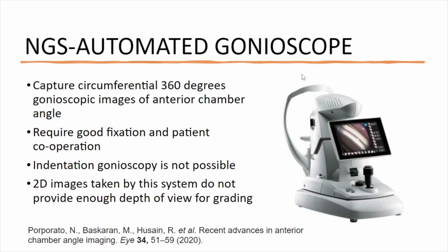But as Bhaskar said, there is no substitute for a good gonioscopy. So it's more important that you spend time learning gonioscopy. You do definitely need to know about this, but gonioscopy is what is going to be your in-pocket imaging system.